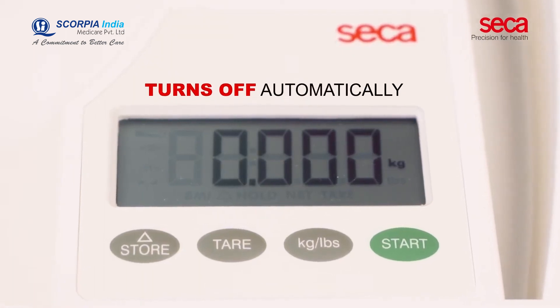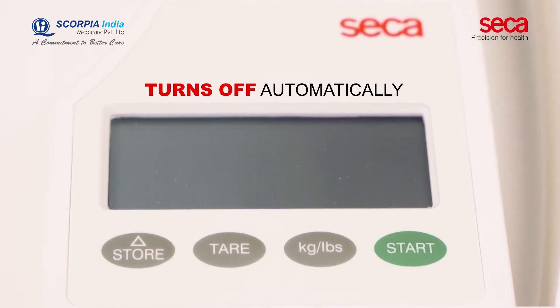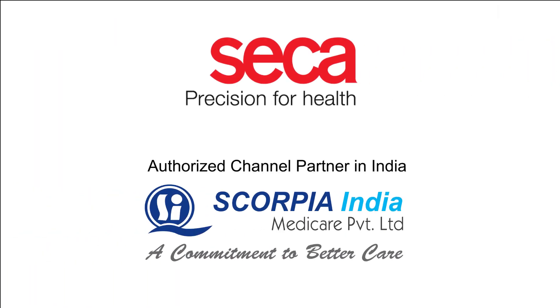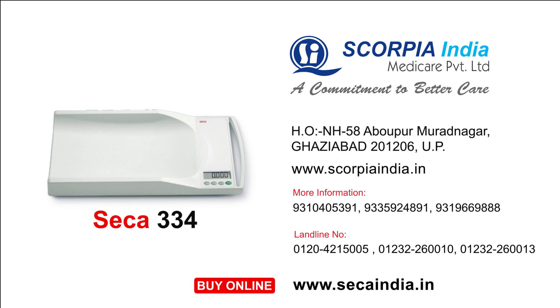To ensure a long battery life, Sika 334 turns off automatically when not in use.